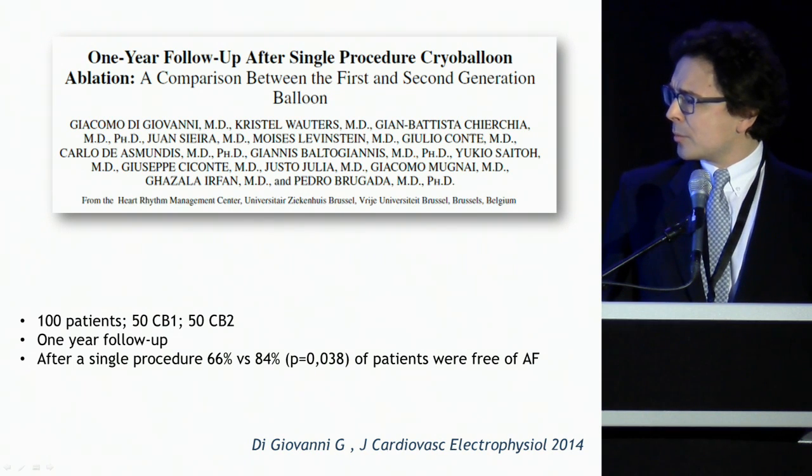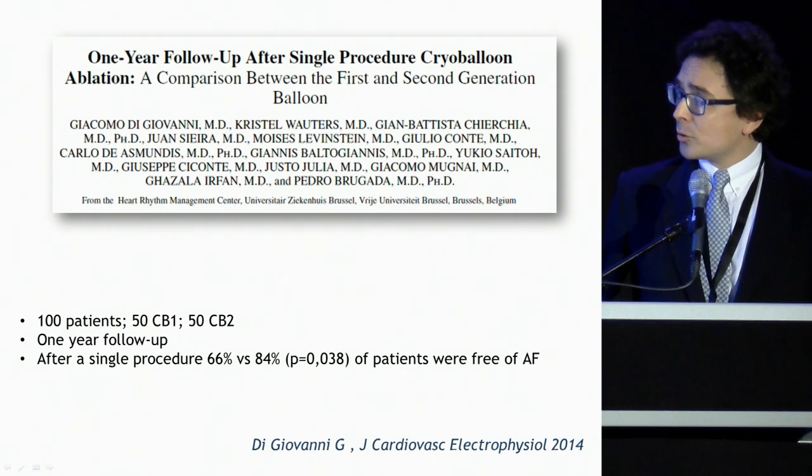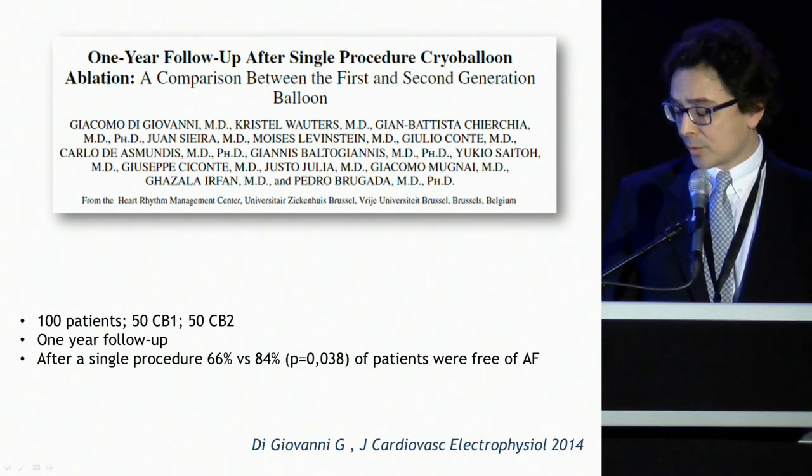Again, this is a paper coming from our group. We compared the outcomes between the last 50 patients with the first generation cryoballoon performed in our center and the first 50 patients with the second generation cryoballoon. And what we saw is that after a single procedure, 66 versus 84% of patients were free of AF. So the second generation cryoballoon was significantly better in terms of 1 year outcome compared to the first.